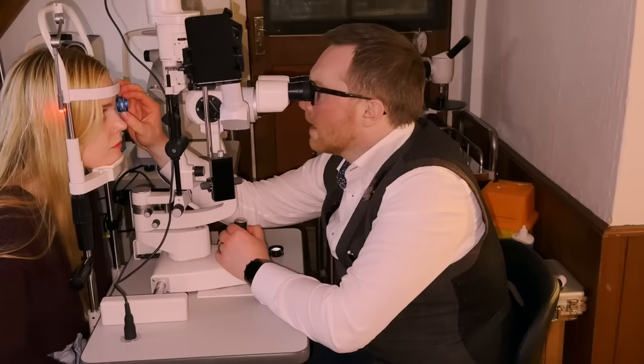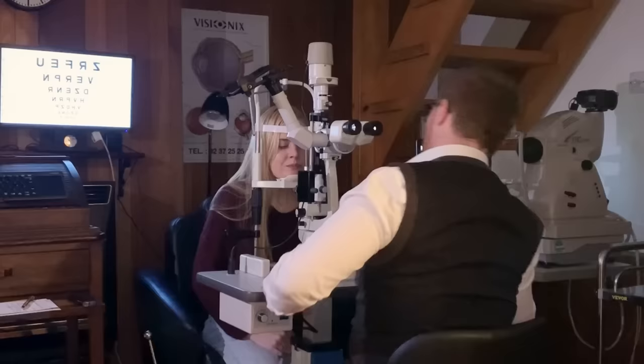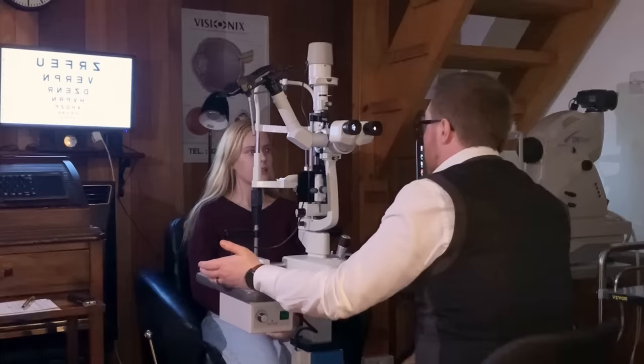And then having a look past my ear again. And again, it's just going to get bright for a moment. Very good. And sit back. That's it for the interrogation light. So yeah, eye's looking very healthy. There's a slight freckle at the front of your eye, on the white of your eye, on your right eye. Perfectly normal, perfectly harmless, just like having a freckle anywhere else.